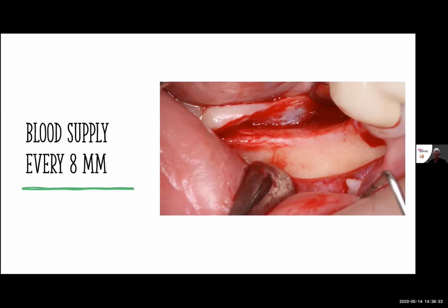Well, this is the part that took me a little while to figure out. But if we had a full flap that's done in a traditional flap like this, we're going to want to make holes. We're going to take a 1/4 round burr is what I typically take. And then from that, I'm going to punch holes in here. And as I punch holes in there, I'm getting bleeding like we talked about before. We get lots of those punched.